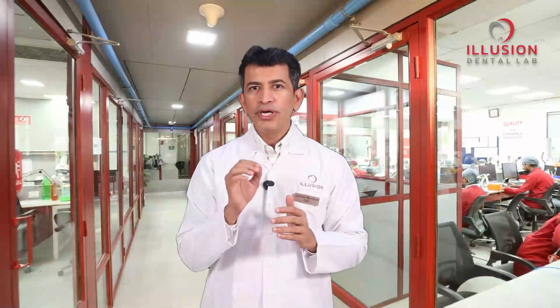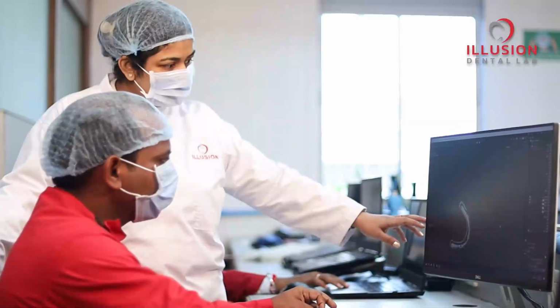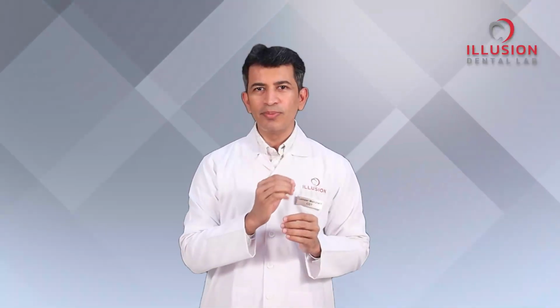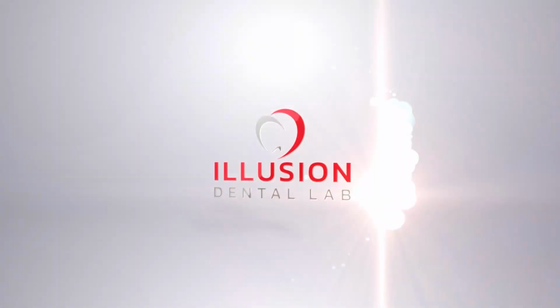And that's how unique and powerful our iBAR prosthesis is at Illusion Dental Lab. We don't just make prostheses, we combine cutting-edge technology, digital workflows with prosthodontic expertise so you can confidently deliver life-changing smiles and win the patient's trust. With Illusion, precision isn't a promise, it's a guarantee. Your growth is our success.